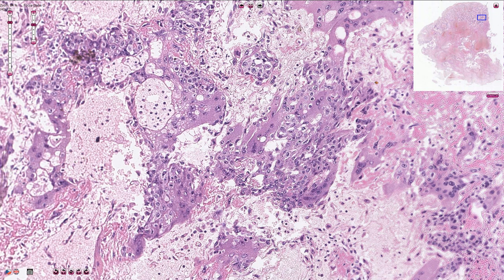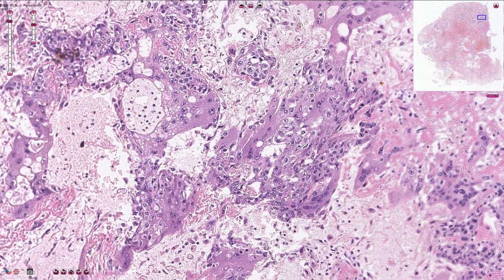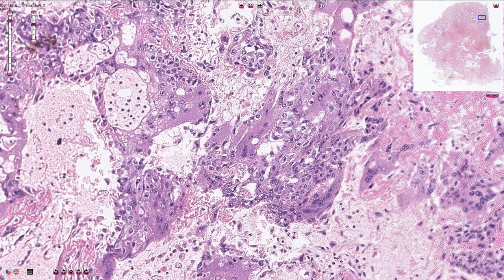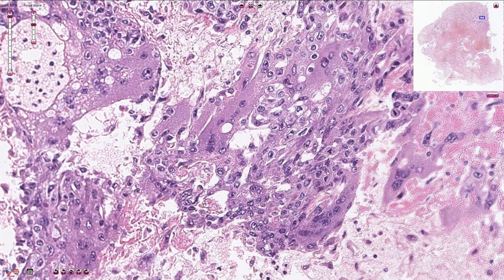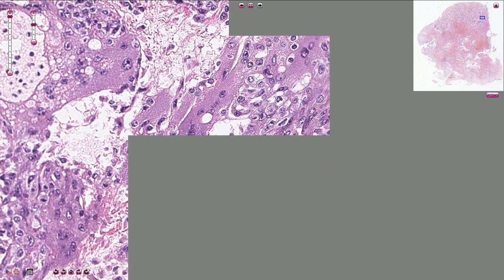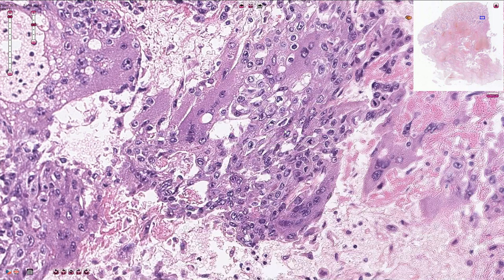On higher magnification we can see the cytotrophoblastic component, which is formed by atypical cytotrophoblastic single cells, and the syncytiotrophoblastic component with these multinucleated elements. Mitotic figures are quite frequent — here we have mitosis here, here, and also here and here.